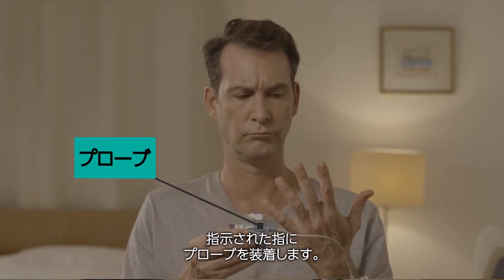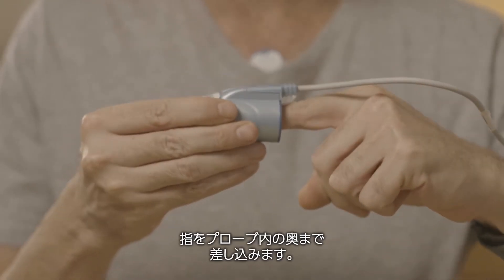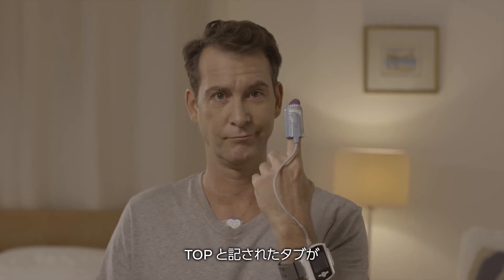Preferably use the index or ring finger. It is normal to feel a little bit of pressure. Insert your finger all the way into the probe. The tab labeled 'top' should be situated on the top side of your finger.